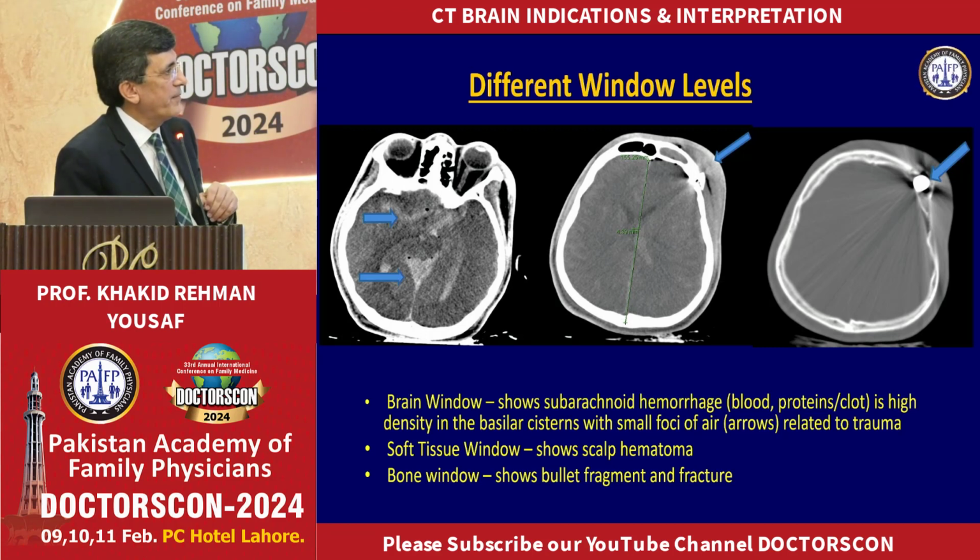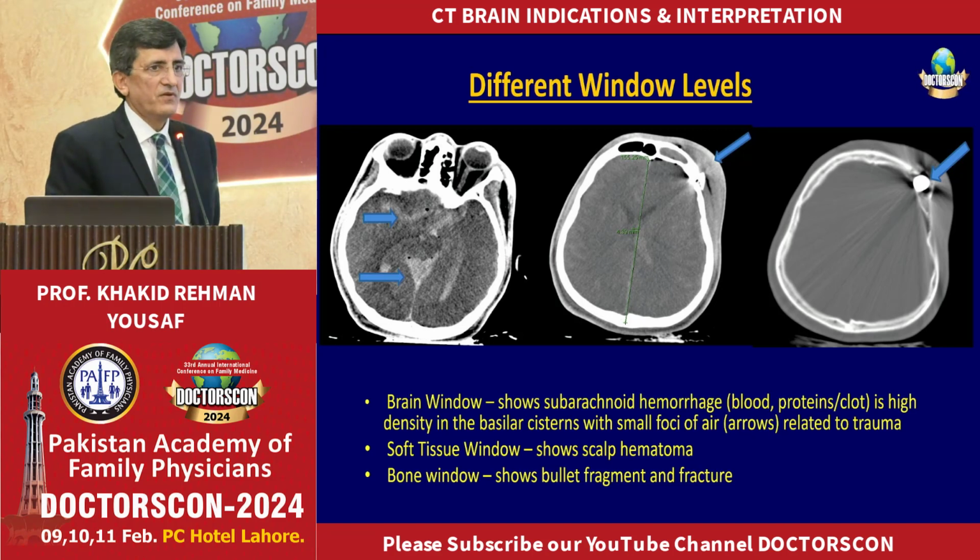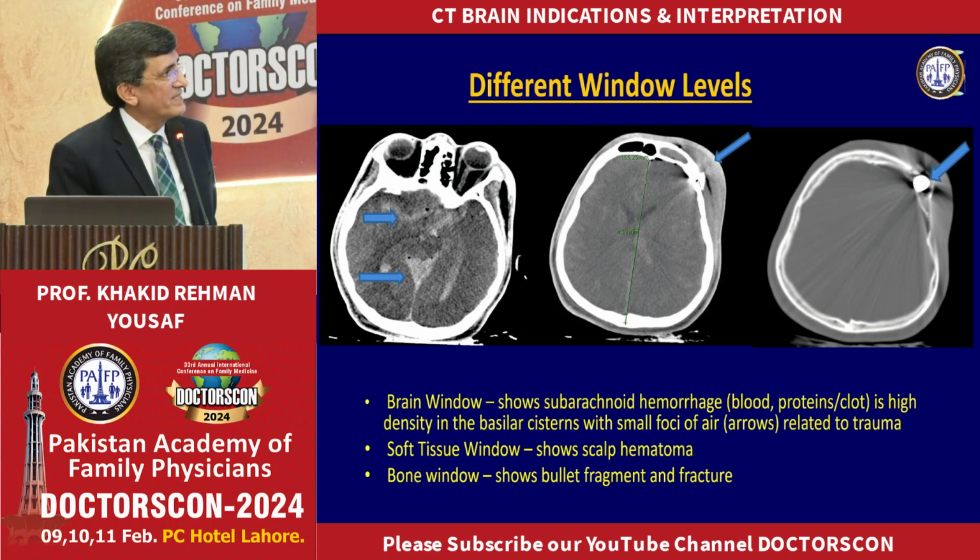This is a subarachnoid hemorrhage, and we set this CT scan on a brain window. When we set this on the brain window, we clearly see the hyperdensities in the brain. For viewing the soft tissues outside the skull, because there is a trauma, there is a bullet here, we set the window at the soft tissue level, and for bone we have to set the bone window level. So different windows are used for different structures while scanning.